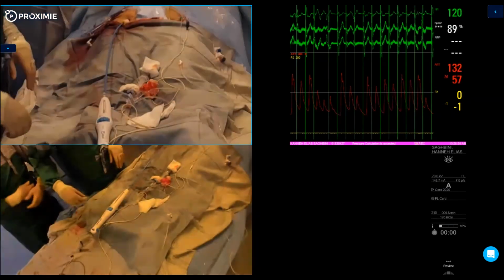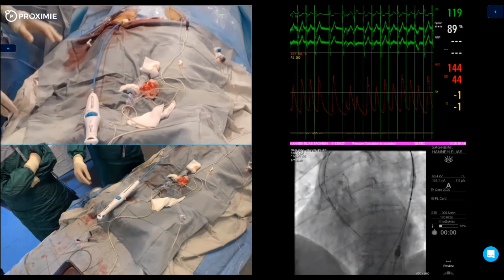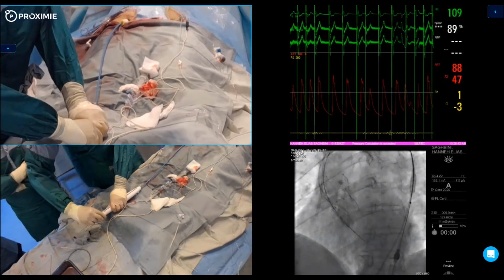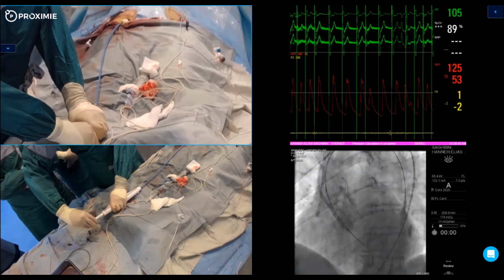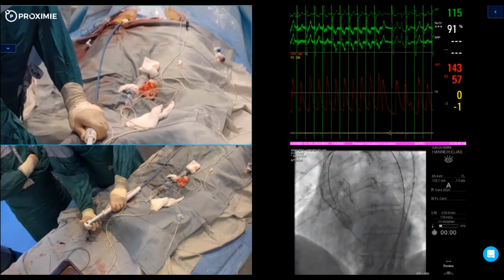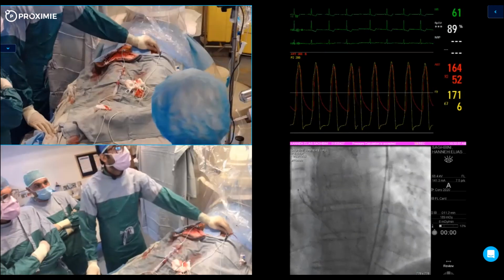Okay. So I'm going to mag down. So now to resheath, what we're going to do, this is the micro handle. I'm going to keep my left hand straight, and I'm just going to resheath like this, okay? It's very easy. Here, I think I don't want to oversheath. That's good.